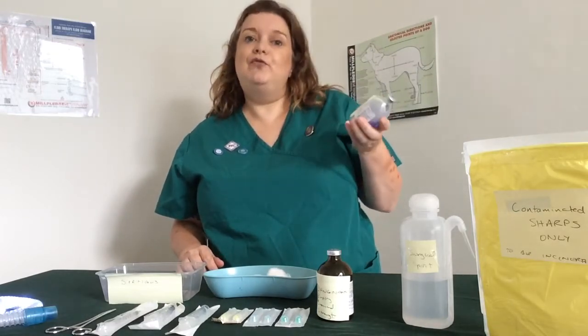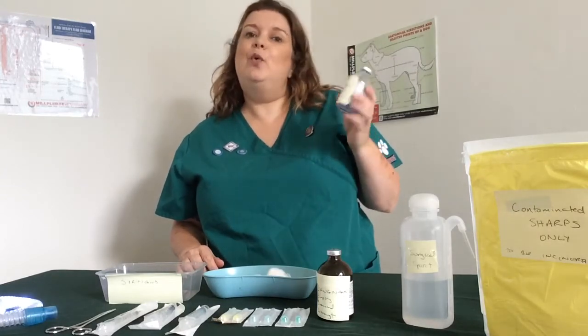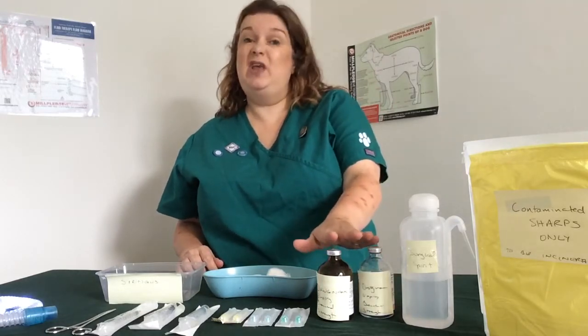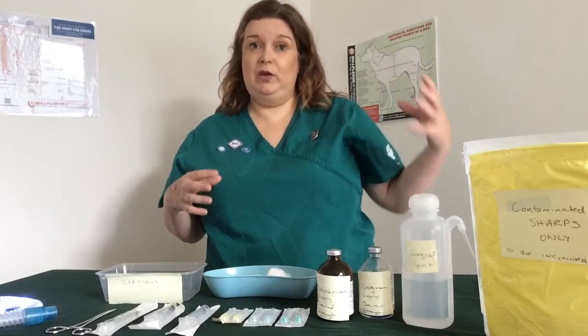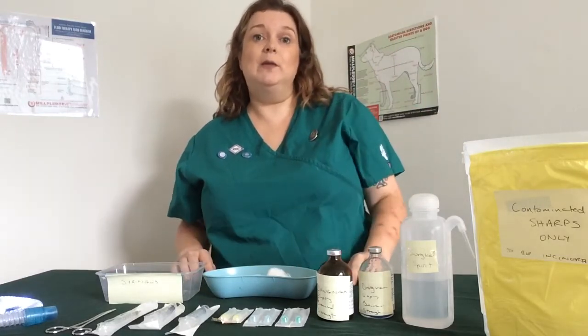You're always going to look for the broach date because you're going to be given one. It should be within 28 days. And then you also want the drug strength because you could be given 2 of these and they might be, say, antibiotics with 2 different strengths. So you want to be able to show that you can take written information and use that to give correctly what the animal needs.